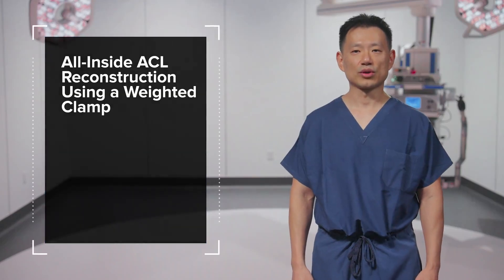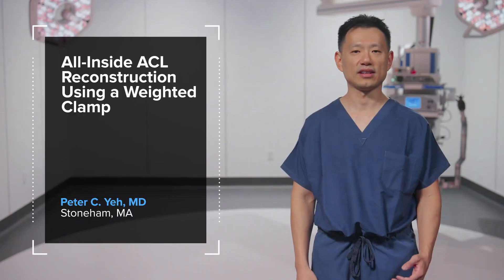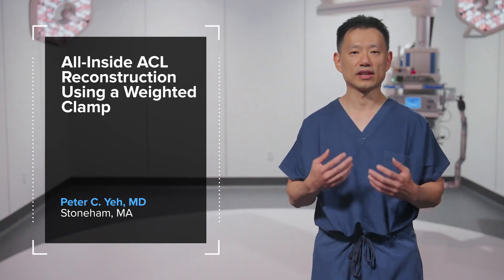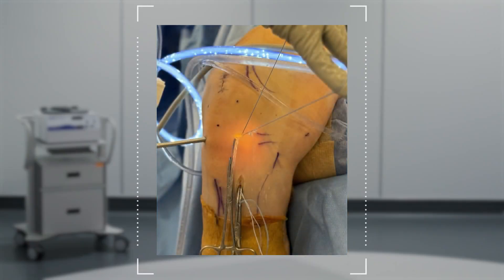All inside ACL reconstructions require a level of precision and preparation, as proper graft and suture management are keys to ensuring a smooth case. Here's a simple but very effective way to pass the graft into the femoral socket. Rather than having an assistant's hand pulling on the tibial shuttle loops, I use two clamps to weigh down the tibial shuttle loop suture that comes out of the AM portal and tibial incision, taking advantage of gravity to tension it down and out of the way.